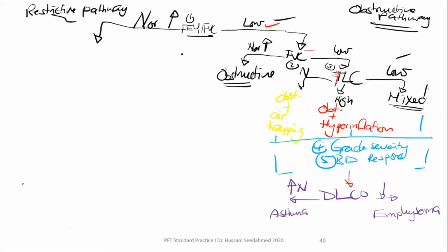بنفس الطريقة الخطوة الثانية، بعد ال FEV1 FVC هعاين إلى ال FVC. Look at the FVC. So step number 2 برضو هنا زي دي. Now if the FVC is normal, يعني ratio normal or slightly high, well, FVC is normal. This is a normal spirometry. This is normal.